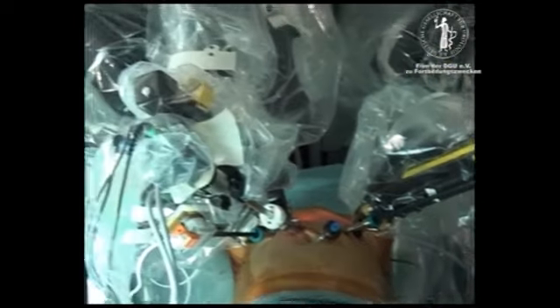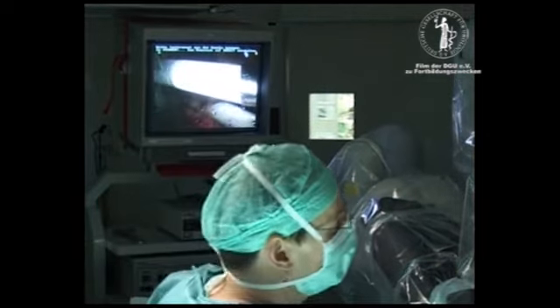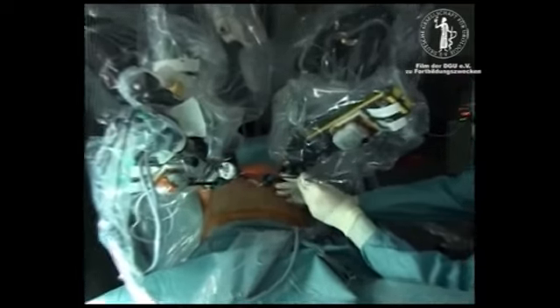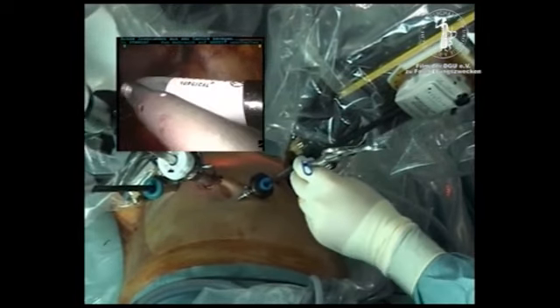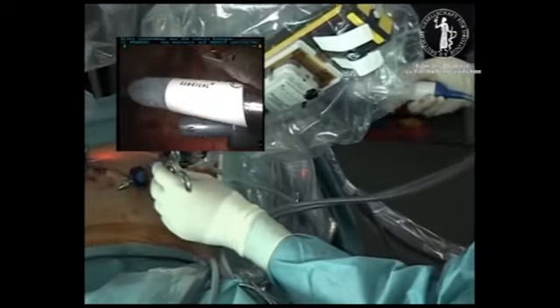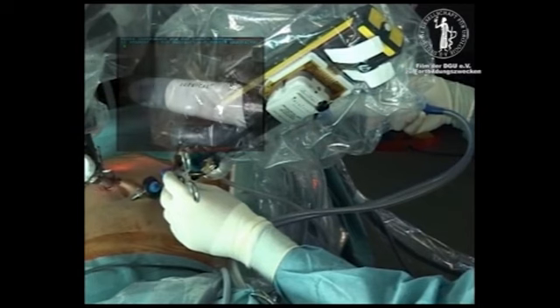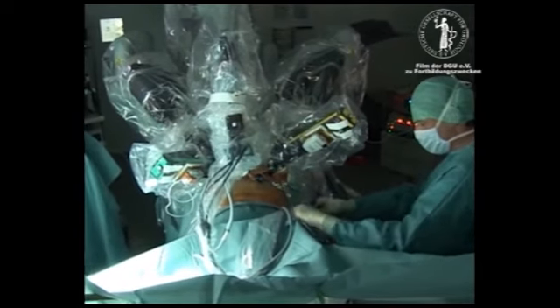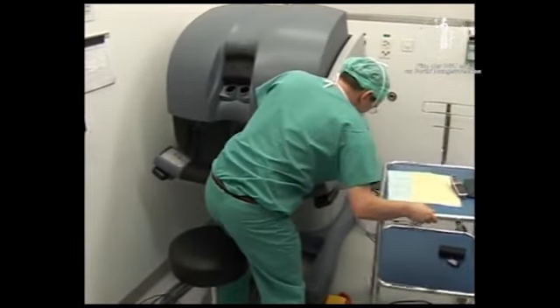The endo-wrist instruments are inserted under visual control. The monopolar scissors on the right side and the bipolar forceps on the left. We use the grasping forceps for the assistant in the medial 5 mm port and the suction through the 12 mm port. Both cautery cables are connected and the surgeon can take his place at the console.